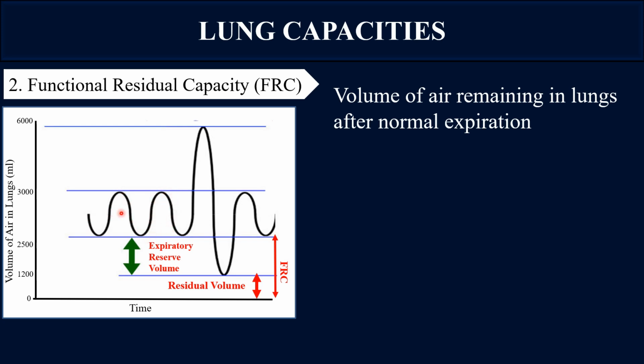So this tidal volume is the normal breathing, and this is the normal exhalation. After normal expiration, a forceful expiration to the maximum level is the expiratory reserve volume. So this is the maximum expired air, and then again this is the inspiration.